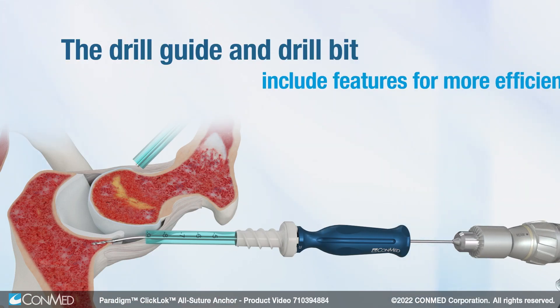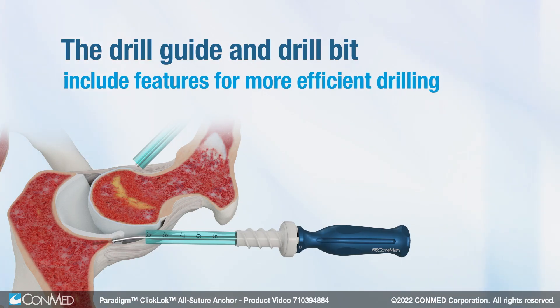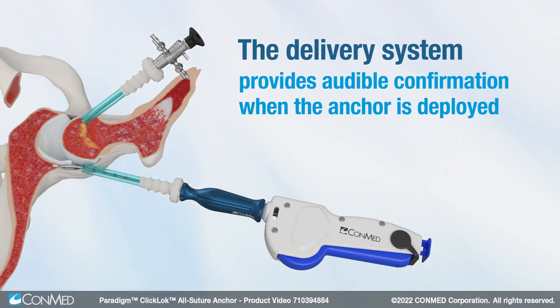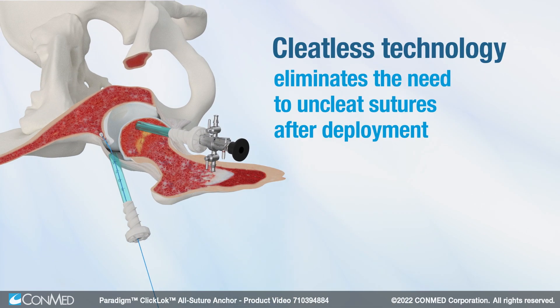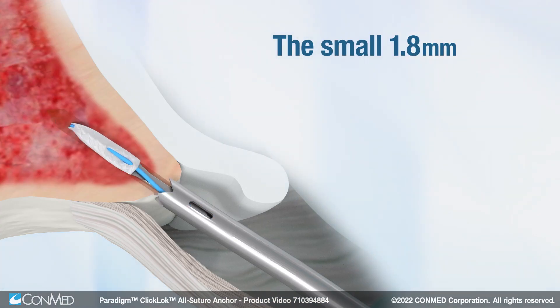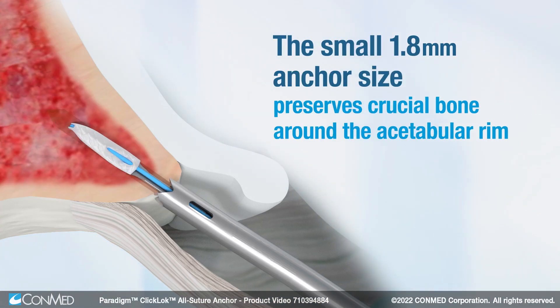The drill guide and drill bit include features for more efficient drilling, and the delivery system provides audible confirmation when the anchor is deployed. Cleatless technology eliminates the need to uncleat sutures after deployment. The small 1.8mm anchor size preserves crucial bone around the acetabular rim.